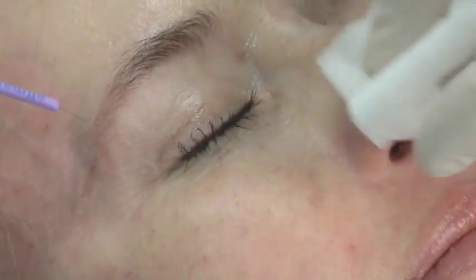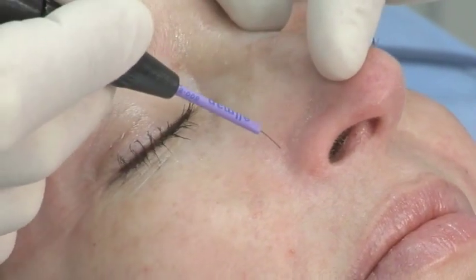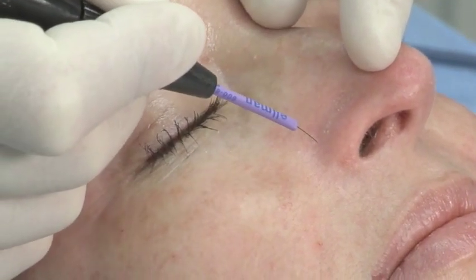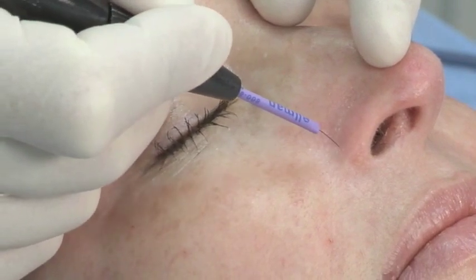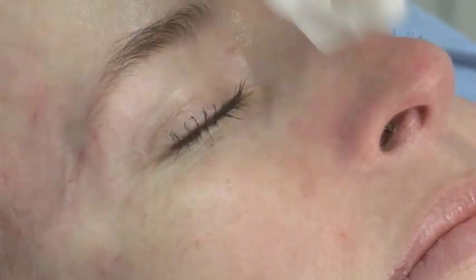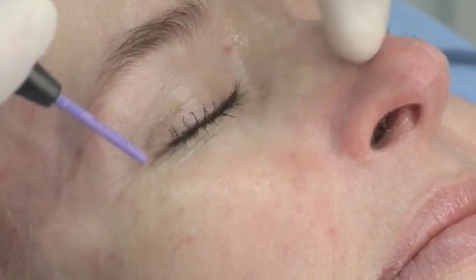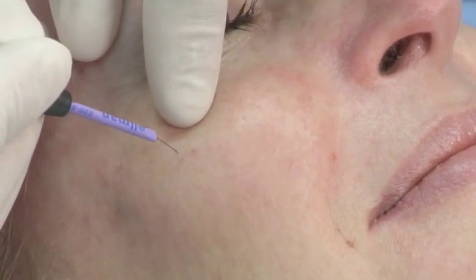I use loop magnification a lot of times for these very, very small ones. You're essentially getting inside the little small telangiectasia, the little vessel — the capillary — and it really just coagulates these little endpoints. We've just used topical to anesthetize it. I think it's pretty tolerable, but we'll ask Robin. She's not trying to hit me or anything yet, so she seems to be doing okay with it so far.